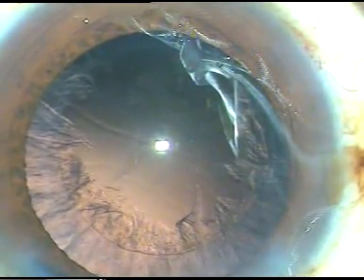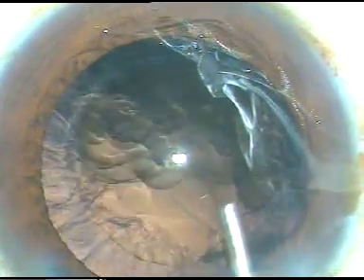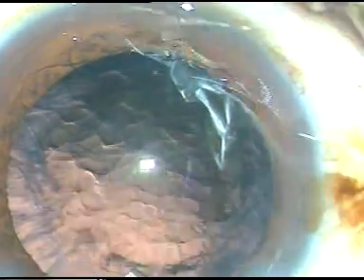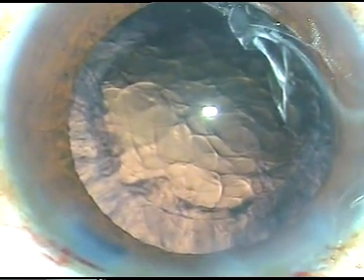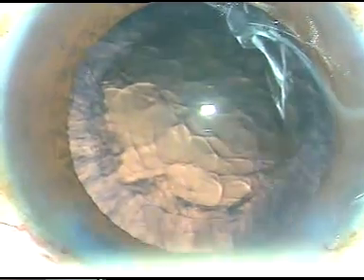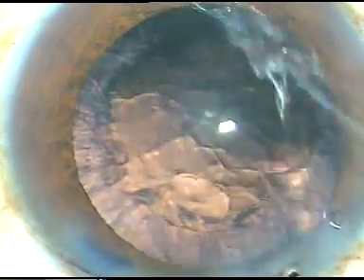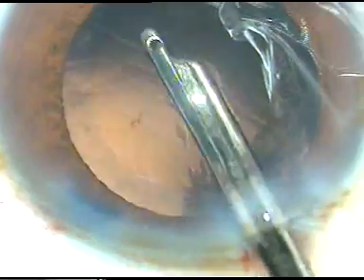Now a little bit of viscoelastic substance is injected. Cortical clean-up can be done by bimanual IA or coaxial IA. I use this very simple instrument — a 23 gauge Simcoe cannula — because it works very well in my hands and it is faster actually.